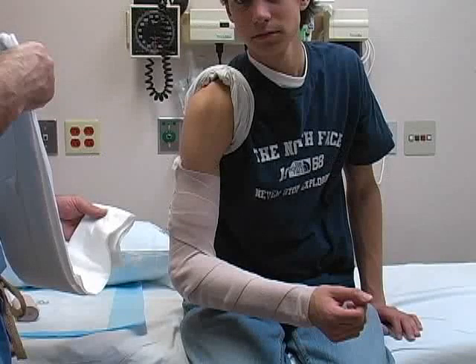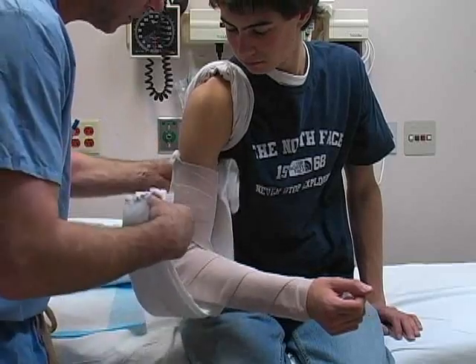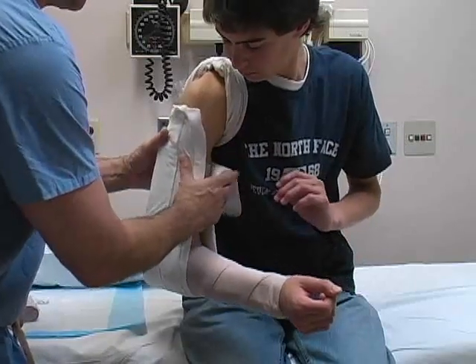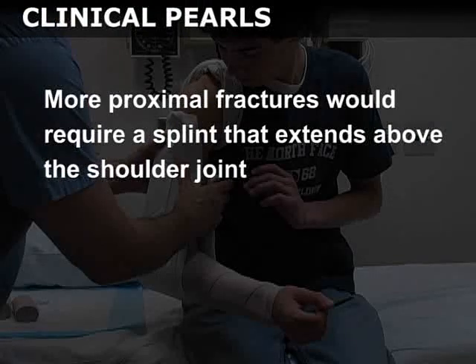Apply the splint to the patient's arm, beginning in the axilla, wrapping it around the elbow, and then up the lateral aspect of the arm. In this example, a short coaptation splint was applied, which would be appropriate for distal humerus fractures. More proximal fractures would require a splint that extends above the shoulder joint.